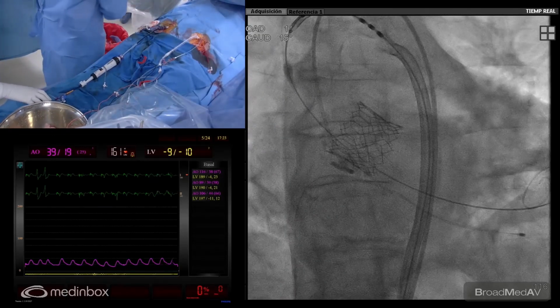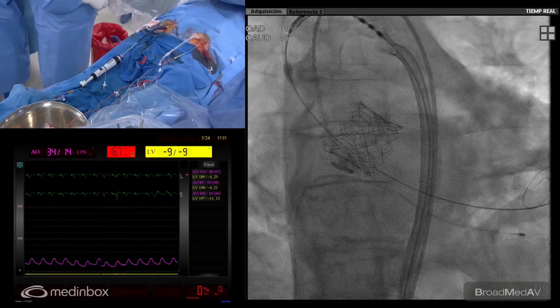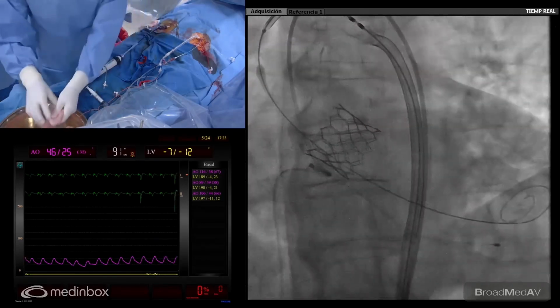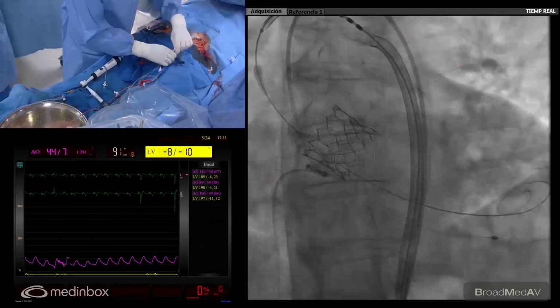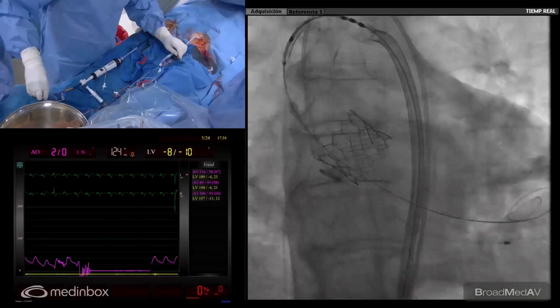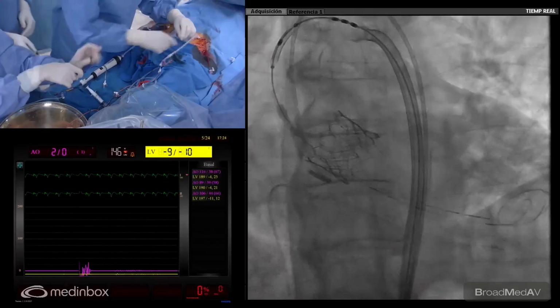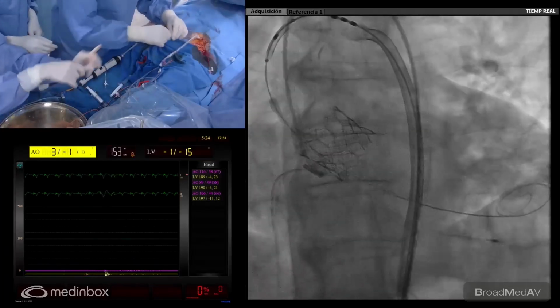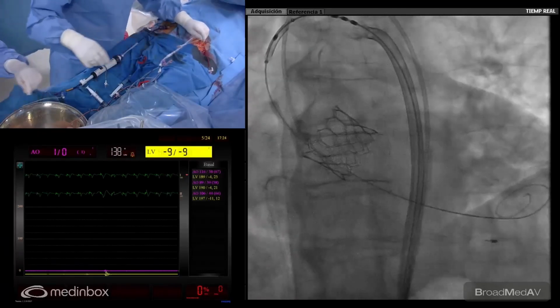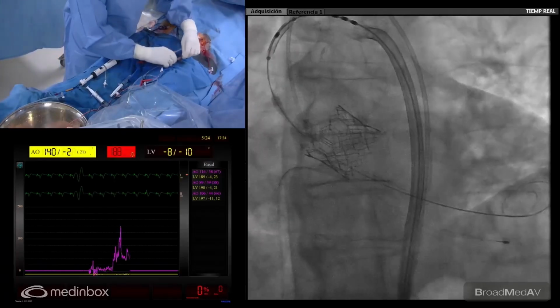Give me some here, Nora, here for the central line. No. Central line there. Okay. He's recovering. Give me the Amplatz wire. Well, this is a very unexpected situation again. But adrenaline.